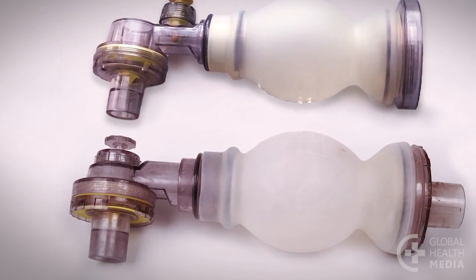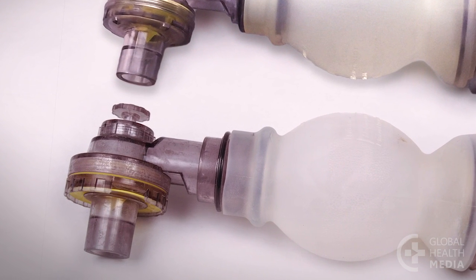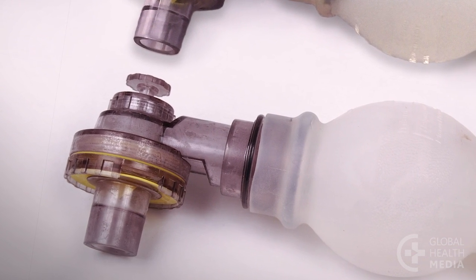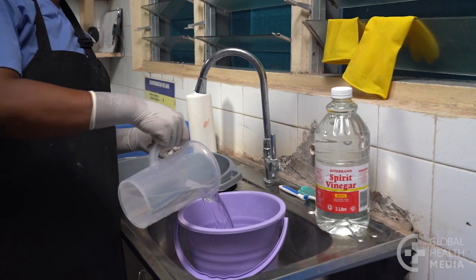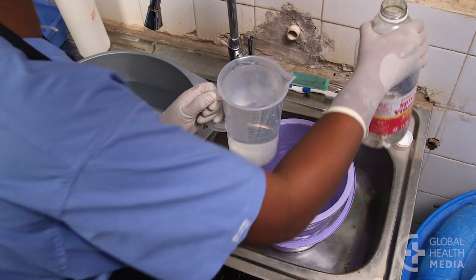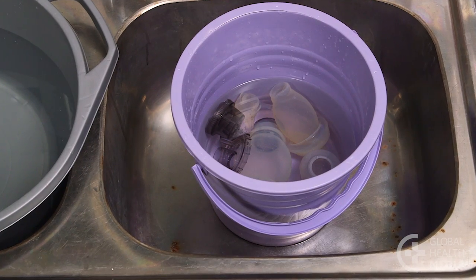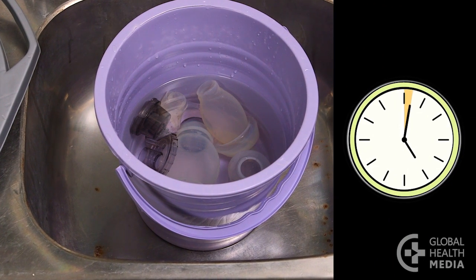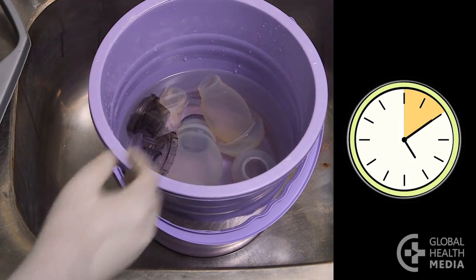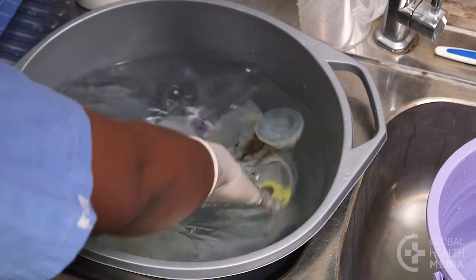If you see a light, chalky material on the equipment, it's likely to be a buildup of minerals and should be removed. Make a solution of equal parts water and white household vinegar. Soak the submerged parts in the solution for 10 minutes. Then rinse them in a bucket of clean water until they no longer smell of vinegar.